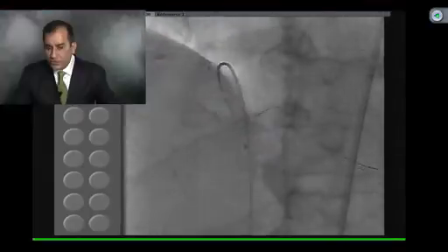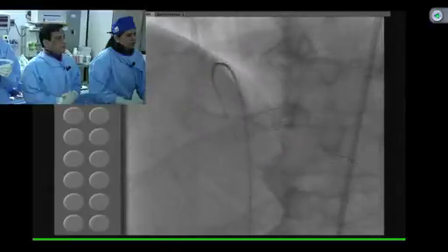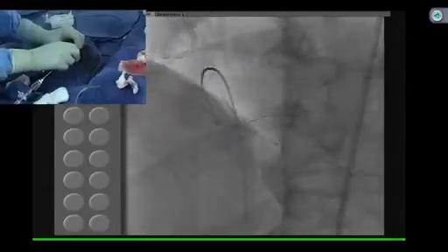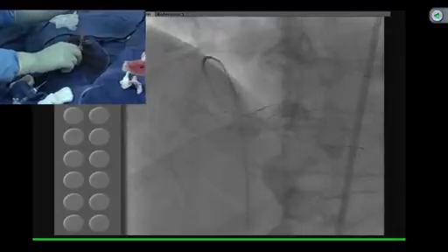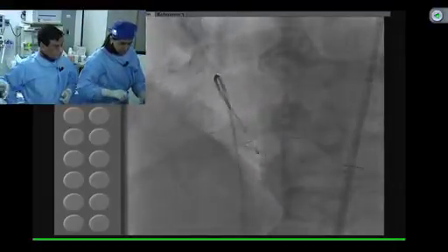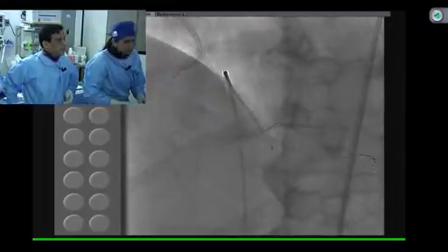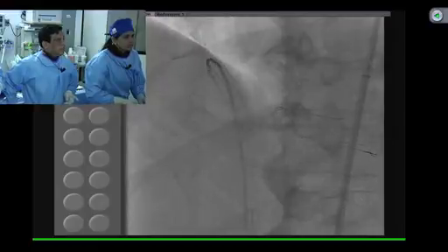And you have always stopped worrying about jailing this wire there. Wires, yeah. Okay, even in this hydrophilic situation, wires. I think jailing a wire is not recommended since you have multiple stents. Yeah, because of the stents, yes. I think you are good. No, but then we have to go through it and dilate that.